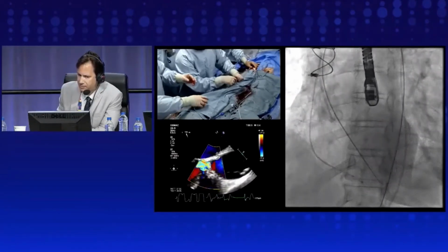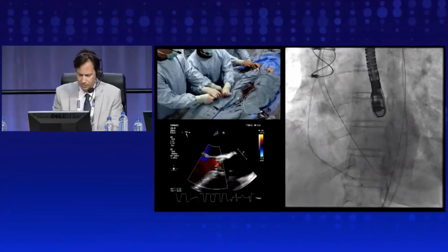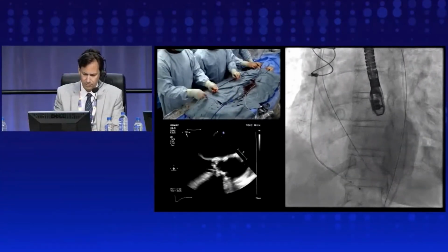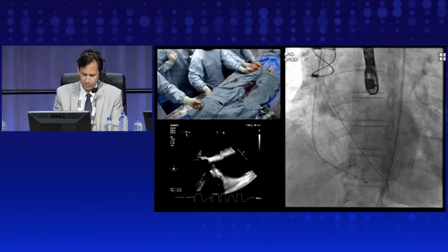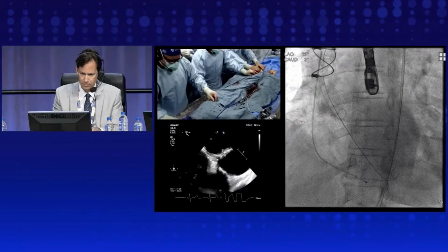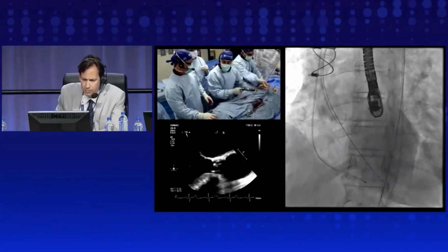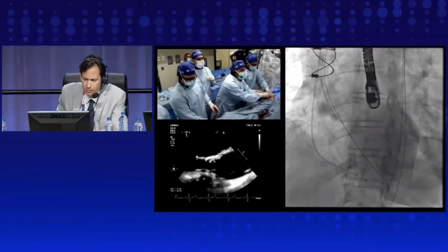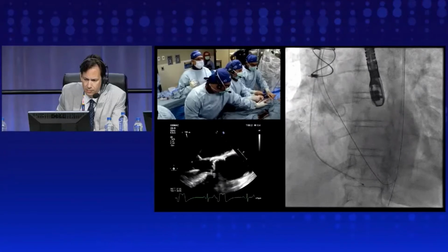Yeah, so right now, as we're working on these cases, we obviously spend a lot of time on the CT. In front of us, we have written in very large, bold letters what the right front, right side view is, what the left side, left front views are. We actually have 3D models that we're doing now, sort of point-of-care 3D constructions. That's been somewhat helpful as well as we continue to better understand how to utilize them.